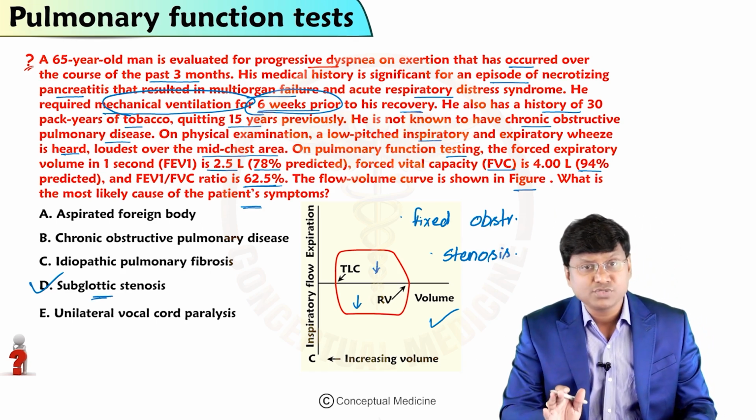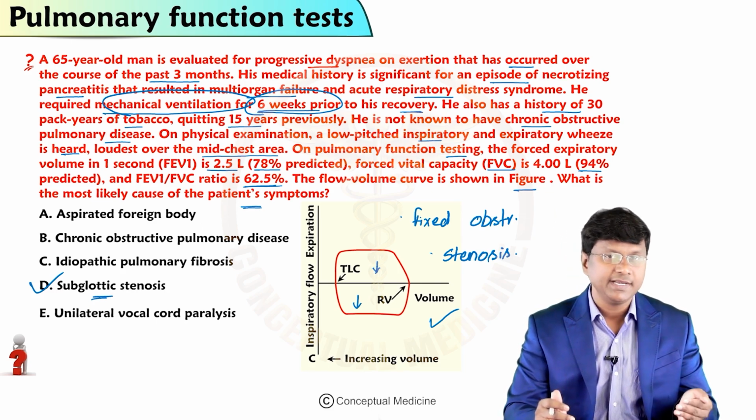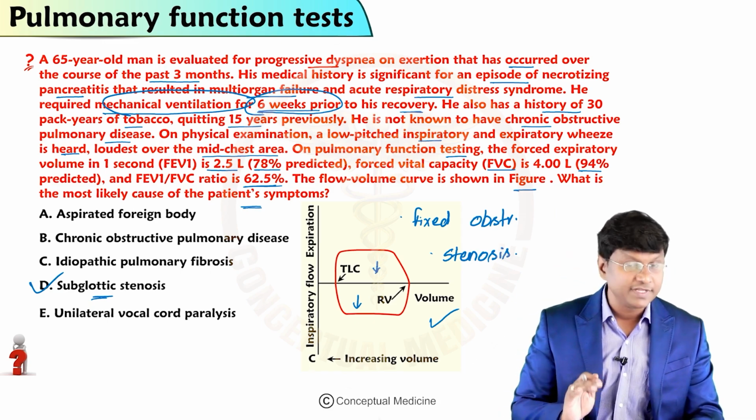So the purpose of your pulmonary function test is mainly to differentiate OLD and RLD, to differentiate intrathoracic and extrathoracic obstruction, and to make out if there is any presence of fixed stenosis.